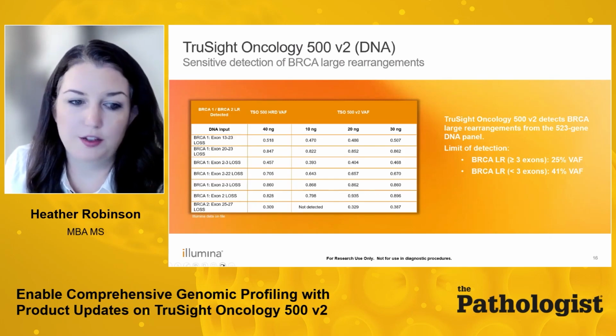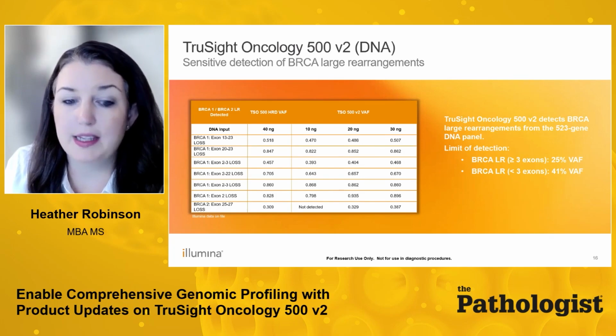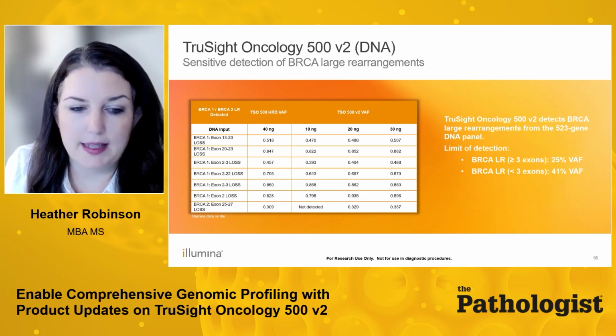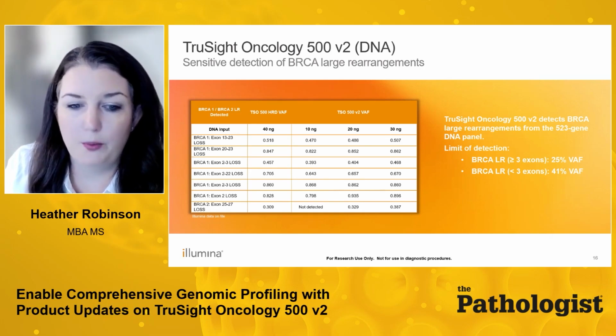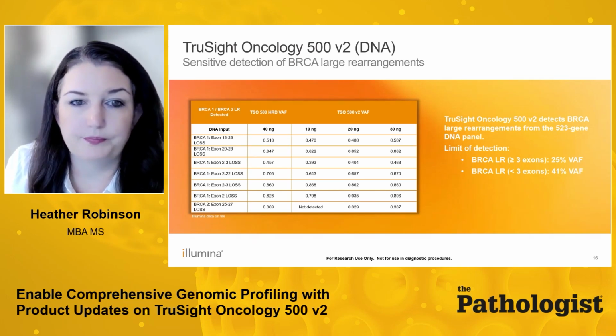TSO 500 V2 also reports BRCA large rearrangements or exon level CNVs. LR calling is sensitive with the V2 assay with a limit of detection of 25% VAF for 3 or more exons and 41% VAF for less than 3 exons.